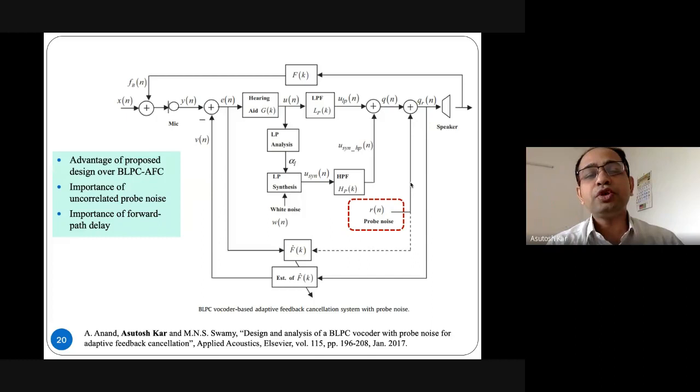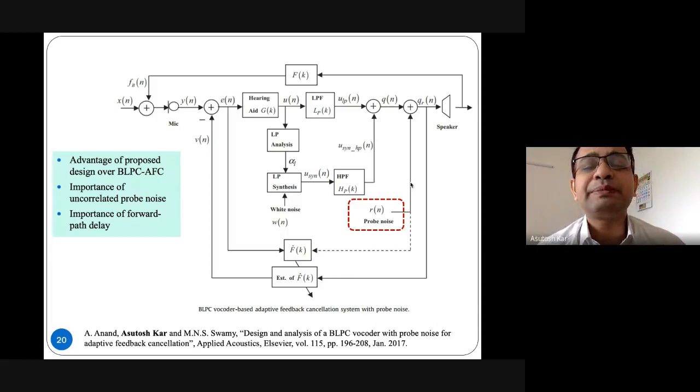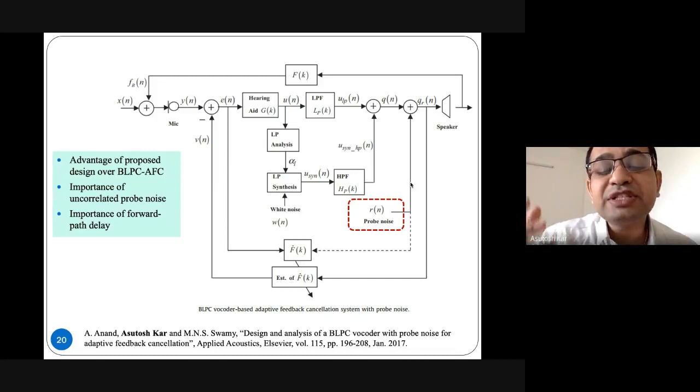So you see, this is our proposed structure. Our proposed part comes from the right hand side. You see, I have circled RN, that is a probe signal. What we did: QN is generated exactly the same as those researchers did. But we found this QN addresses only the high frequency biasing and the low frequency biasing is not addressed. Therefore, we used an estimation concept in adaptive processing, a step-by-step cyclic optimization process.